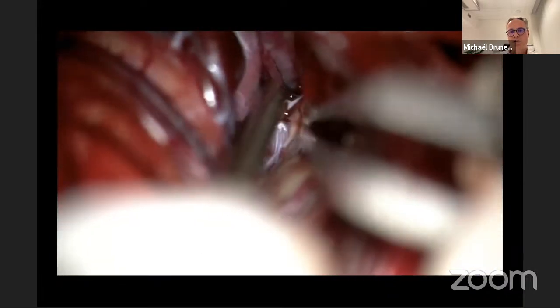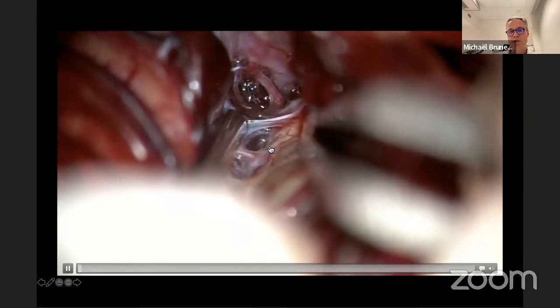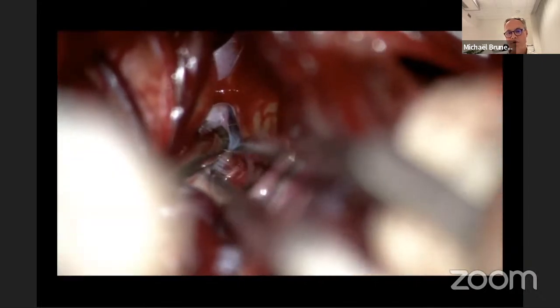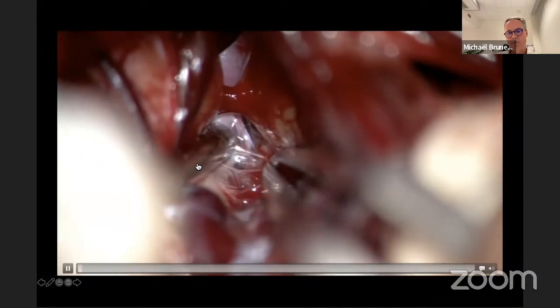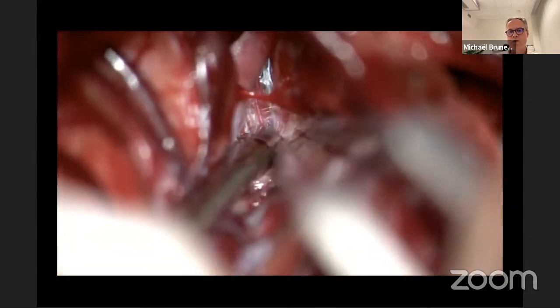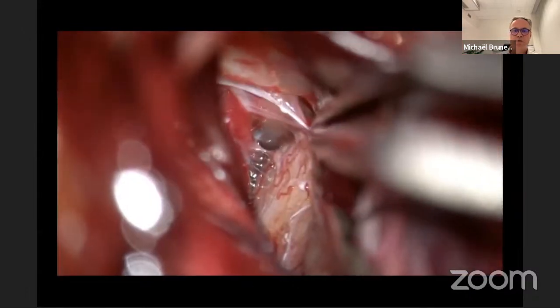You see all the important vessels, the PCOM and branches, the anterior choroidal artery, and gently the temporal lobe is separated from the M1 perforators. A very careful dissection, of course, not to tear any vessel from the main one, otherwise you will be in trouble. Opening the good plane is very relevant.